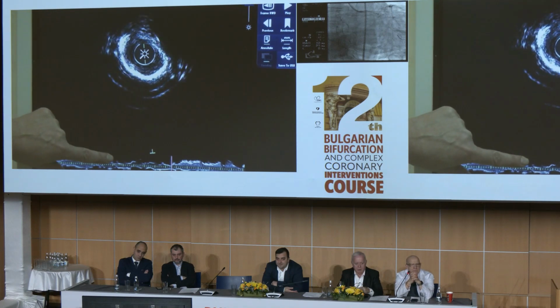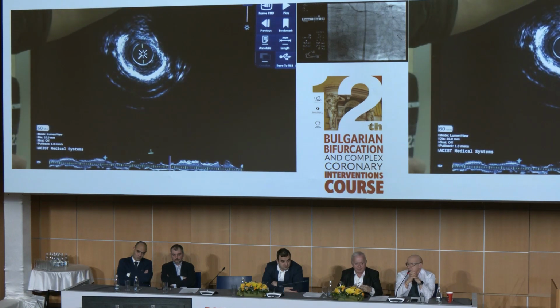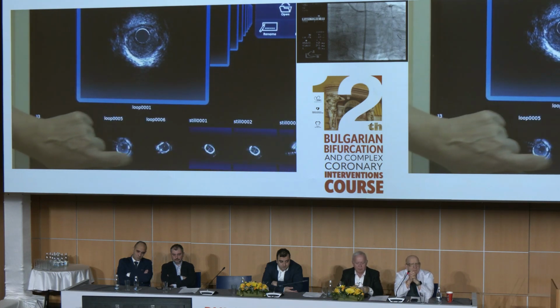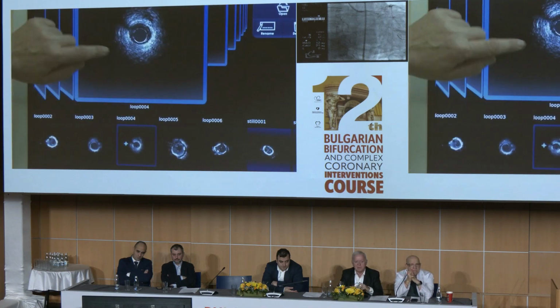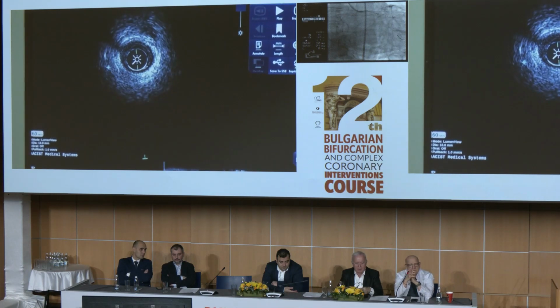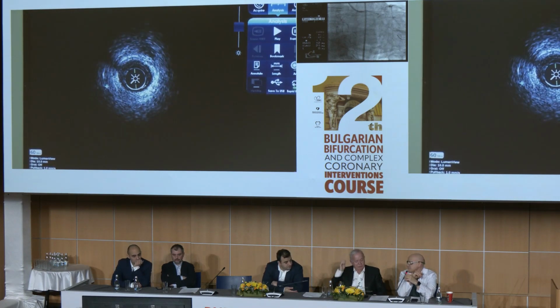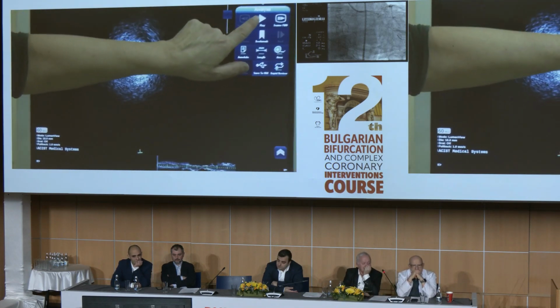If it is not working, probably we have another tool, and this is the shock wave, I mean the lithotripsy. That's a good demonstration of how imaging is important to assess the vessel. Although, to tell you frankly, on angio, if you have calcium well seen on both sides of the vessel, this is a good mark that this is a severely calcified vessel, and probably you should think of a debulking strategy. So this is the IVUS, just to show the IVUS from the circumflex.